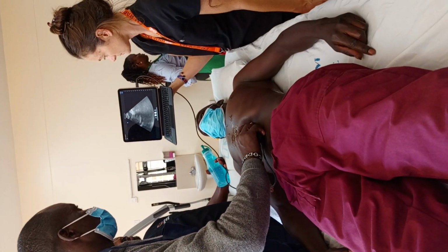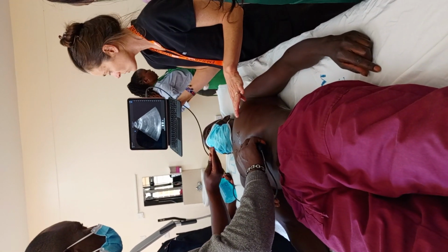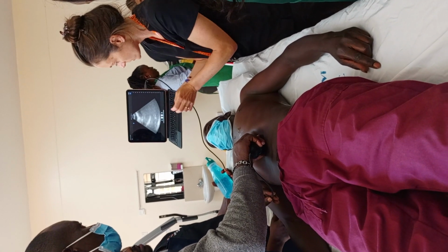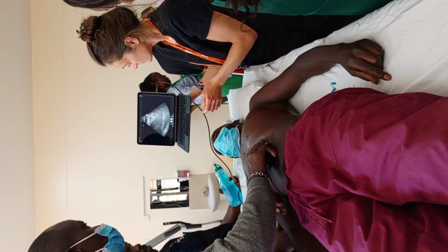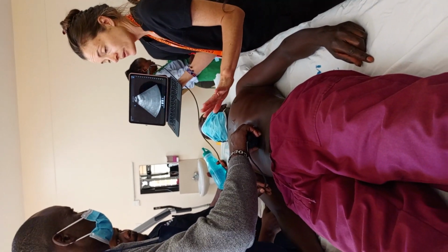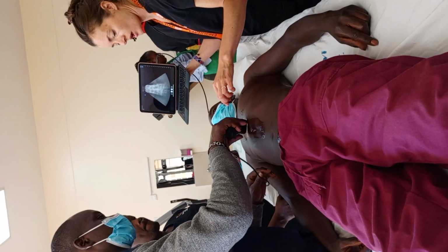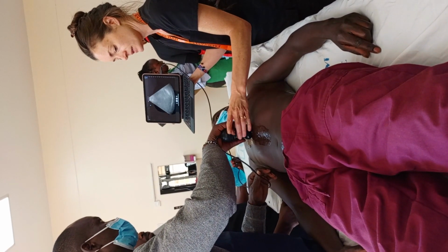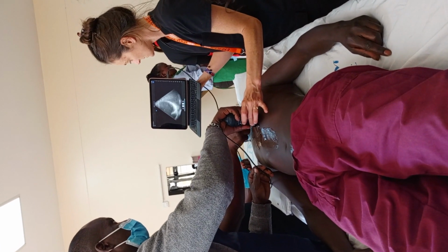Yeah, take your clothes off. So sometimes you don't need quite as much pressure. So I'm starting to see cardiac motion there. Better than this one. This was the knockoff version. So we're gonna keep some. Now again, sometimes if you have trouble finding it, you can look over on the chest wall here. But the lithium batteries, so it's like, wow, I don't think I put that right.